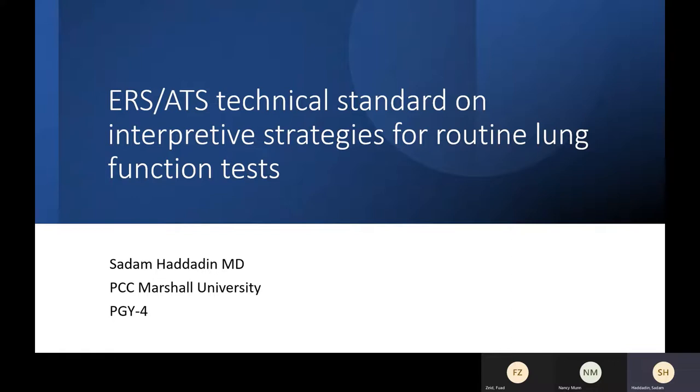Yes, non-specific. And in current and former people who smoked, they usually leave it as preserved ratio impaired spirometry. Also, dysanapsis for anyone else is not specific. Yeah, that's where it changed from the interpreter to the physician. If you are just reading the test and you don't know anything about the patient, you will just interpret the numbers you have. If you know your patient, he's a smoker, and you are the physician taking care of this patient, your interpretation will be different. Okay?